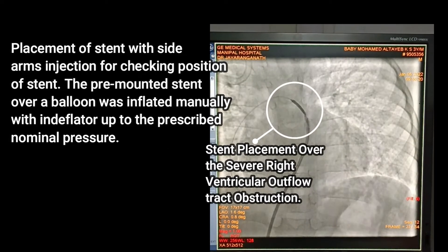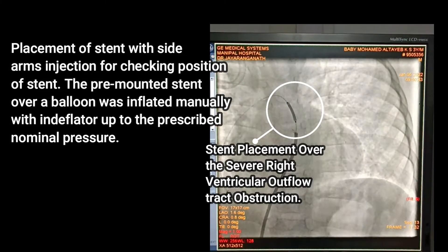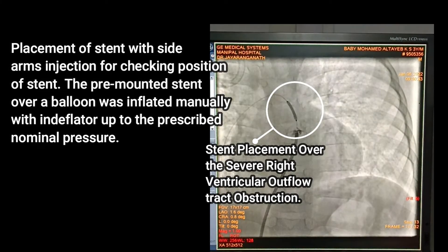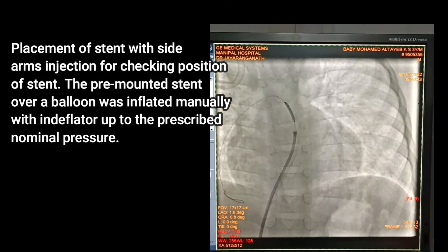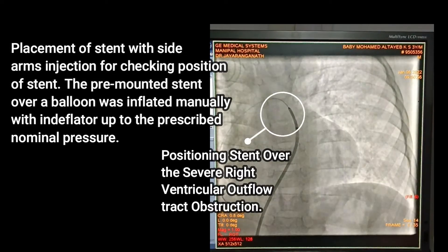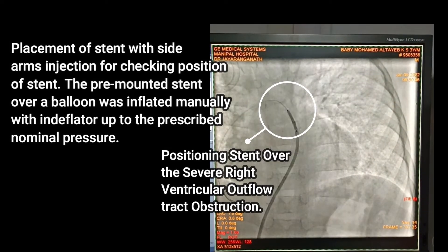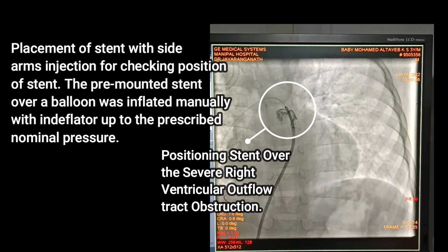Placement of stent. The pre-mounted stent over a balloon was inflated manually with an indeflator up to the prescribed nominal pressure.